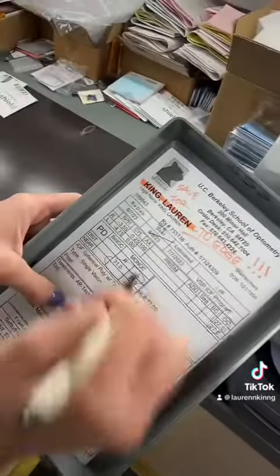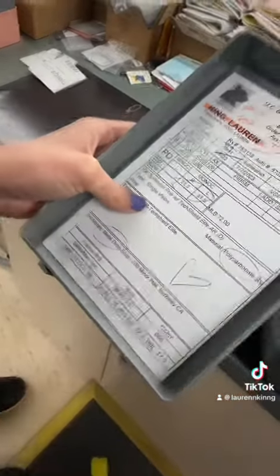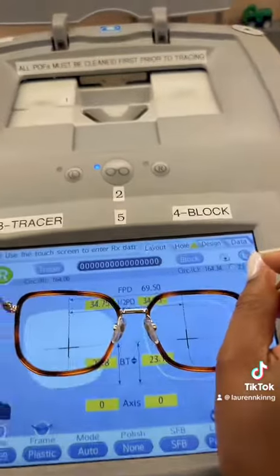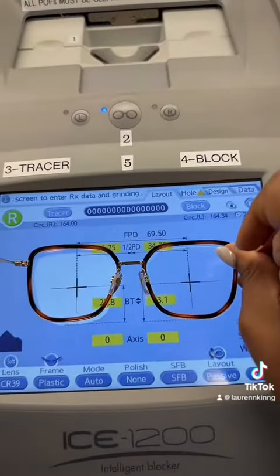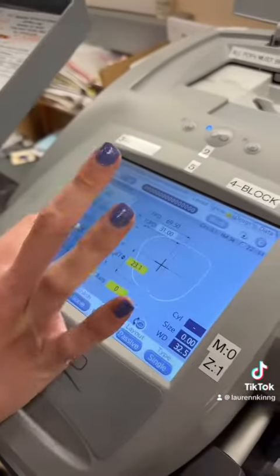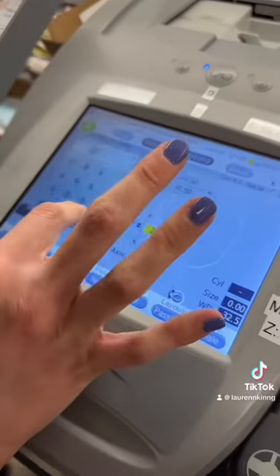Next, we circle all the important information that we'll need to insert into the tracer so that the edger can make the perfect lens. It is very important to make sure that the frame was traced correctly and it matches the actual frames that you have in your hands. This is Jordan inserting all of that important information that we just circled so that the blocking process can run smoothly.